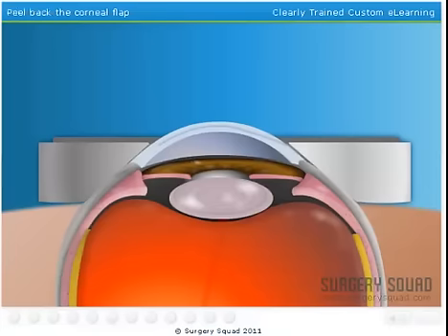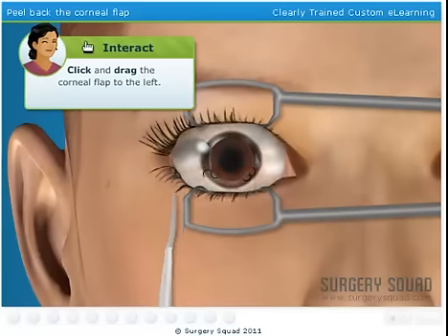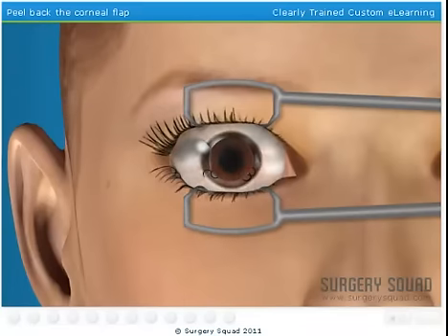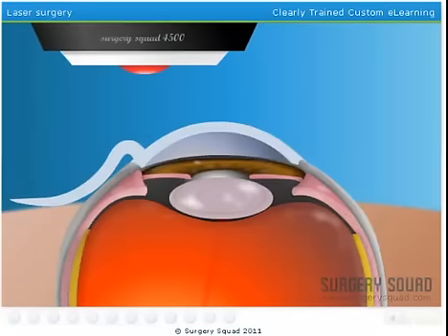With the corneal flap cut, we remove the microkeratome and suction ring and then peel back the corneal flap to expose the middle part of the cornea. This is the part we'll reshape with the laser. The computer-controlled laser is positioned over the eye, and by analyzing our patient's data, we've pre-programmed the laser to tell it how much corneal tissue to remove.